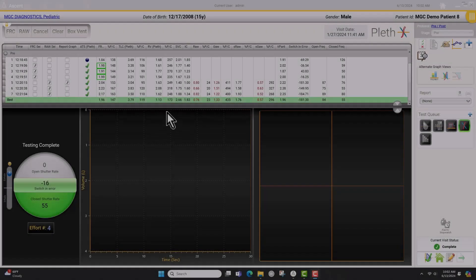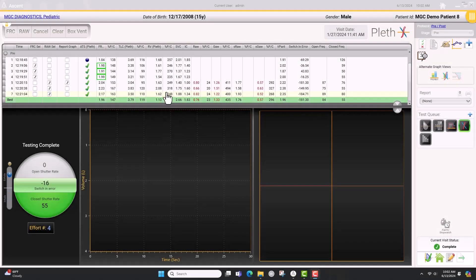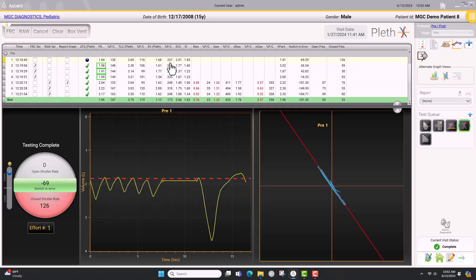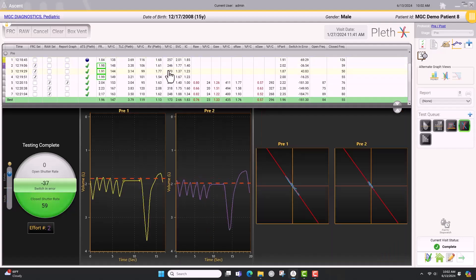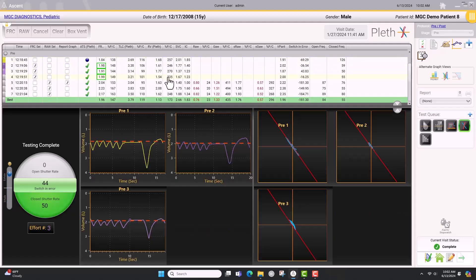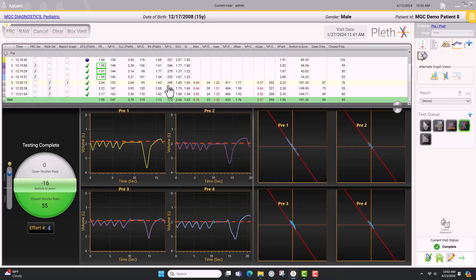While in the test screen, you can draw each effort by clicking on the data for an effort. With the efforts drawn on the screen, you can visually see if any tracing needs adjustment.